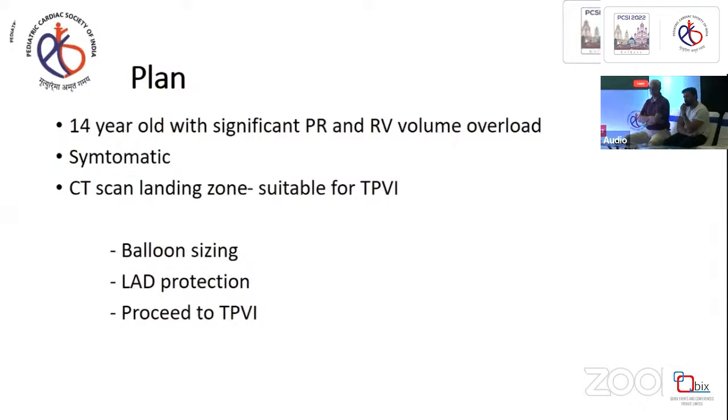I have a question for you, Muthu. Are you pacing from the LV, left ventricle, or from the right ventricle? LV. You are pacing from the LV. Yeah. I maintain the ACT around 250, more than 250 or 300. Okay, can you place the fluoro?